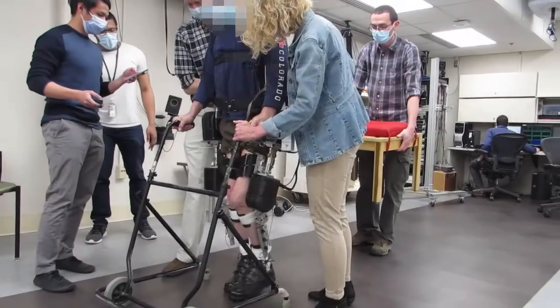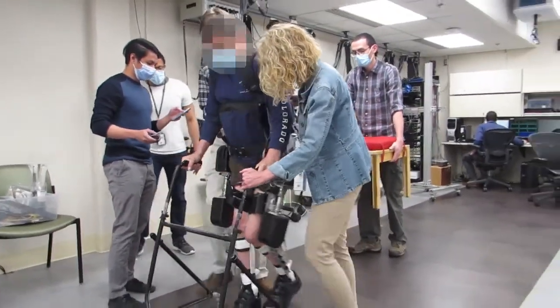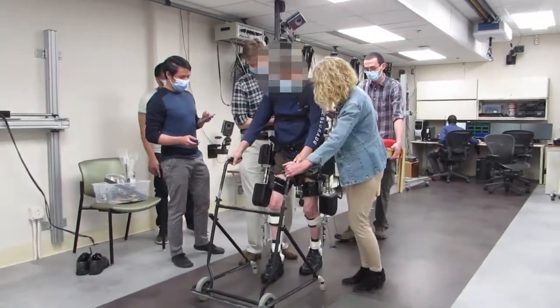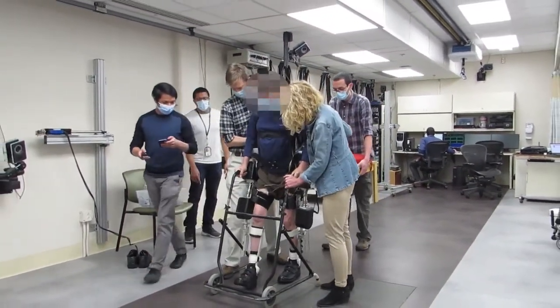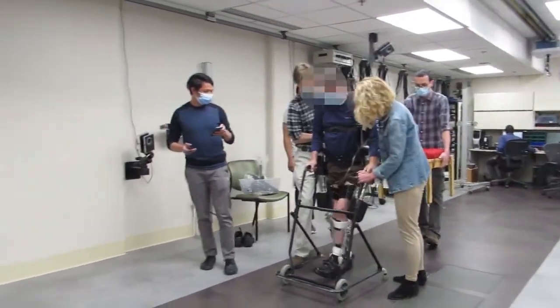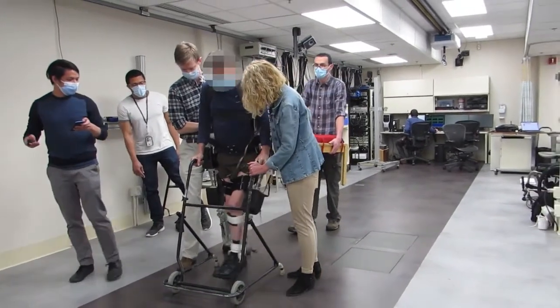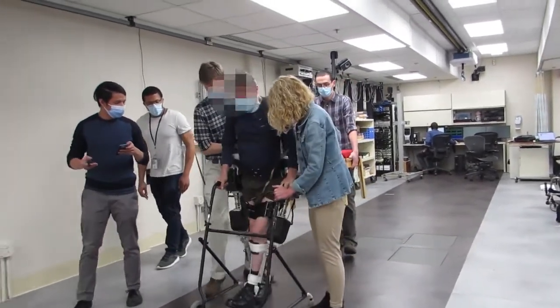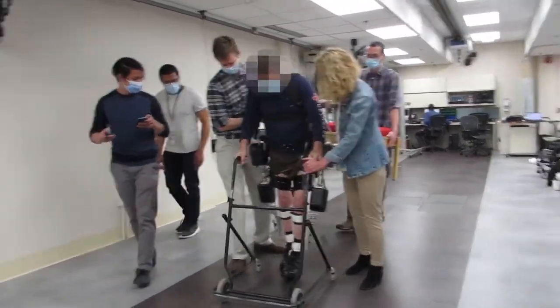We have implemented a biologically inspired terminal iterative learning controller that learns how to step better the longer that it walks, and fluidly distributes the control effort between the neurally stimulated muscles and the exoskeleton motors. The learning algorithm exemplifies the muscle-first philosophy by maximizing recruitment of the lower limb muscles to accomplish stepping, while the motors apply a biologically inspired bursting paradigm to ensure the limb is in the correct configuration for weight acceptance.